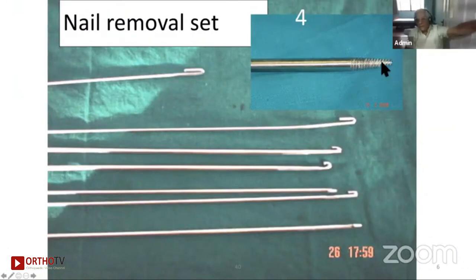But so many times this tip breaks, or over a few uses it will become blunt. And not every time it will bite onto the screw. So I have this hooked K wire. Now you can't hook it the way Dr. Anand has mentioned, such a sharp hook, you cannot do it in the theater. So this has to be pre-bent in the factory. And this is the one which has done really wonders for me at times.